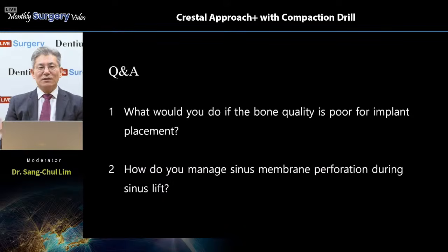For the lateral approach, the perforation case is totally different. The lateral window and elevation are already done, and during the detachment, the sinus membrane tears easily. What is next? How can I overcome this kind of bad situation? So calm down, and don't touch the perforated areas of the sinus membrane anymore, and we have to make a little bit wider window far from this perforated area, right?